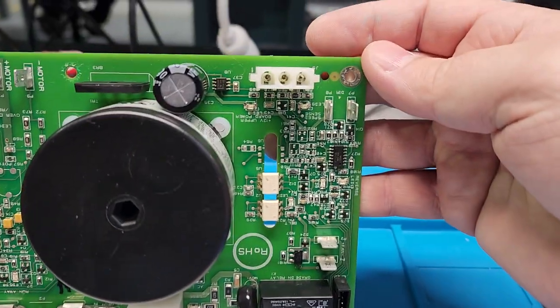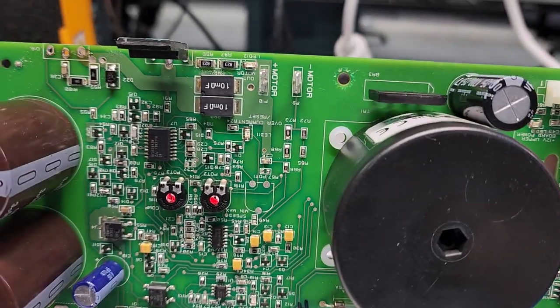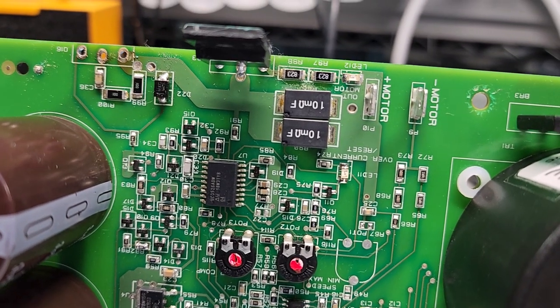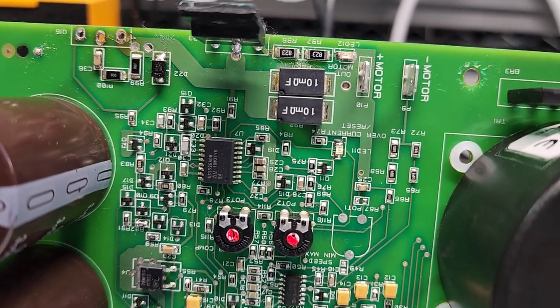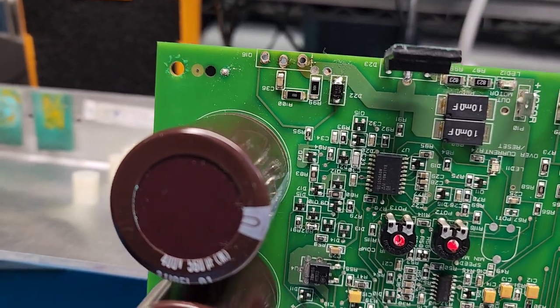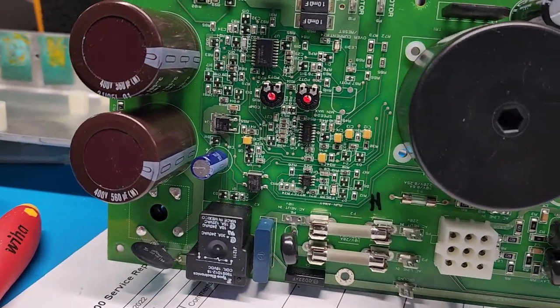And let's see. You can see on this side, right over by those MOSFETs, there is definitely some residue on there, and we have examples of heat, so that's exactly where I'm going to start. Everything else looks pretty good.